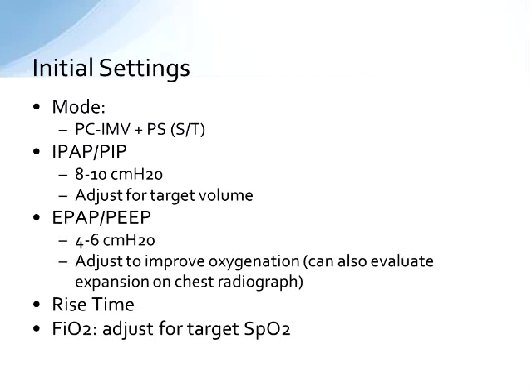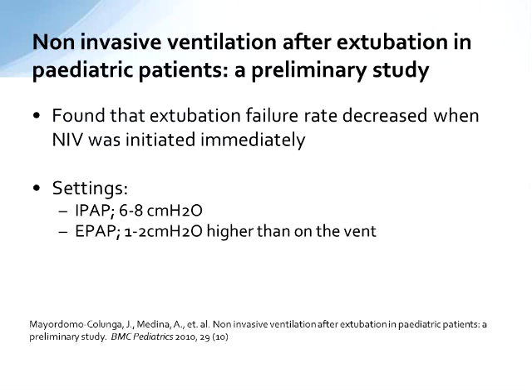Sort of subjectively, at least in what I've seen in my practice, the method that I have on the slide here is better tolerated by our patients rather than starting off at huge pressures that would be really, really uncomfortable to them, and instead starting off at lower pressures and then slowly titrating up. That seems to work better in terms of maintaining compliance with our patients. And again, if they're not compliant, it doesn't matter what we do, because if they're not wearing the mask, it can't be effective at all. So again, two different approaches, but this would be my preference personally.